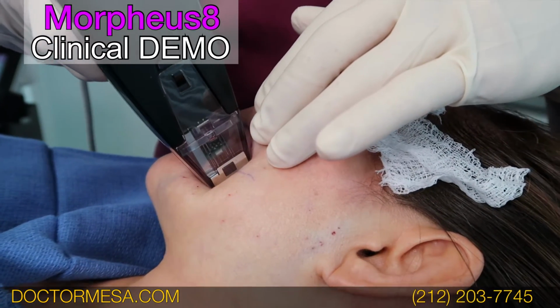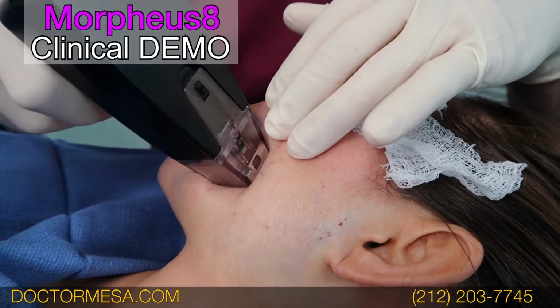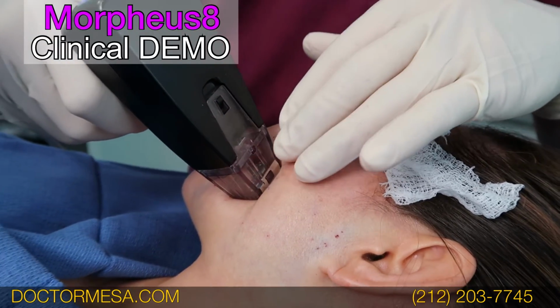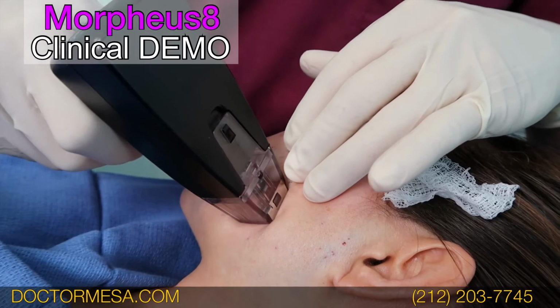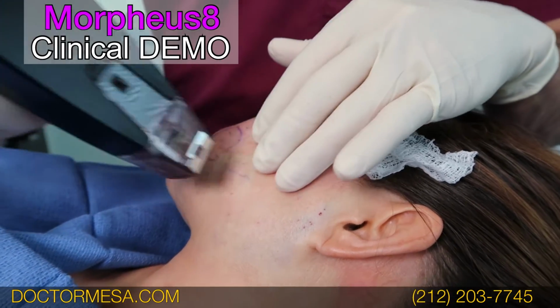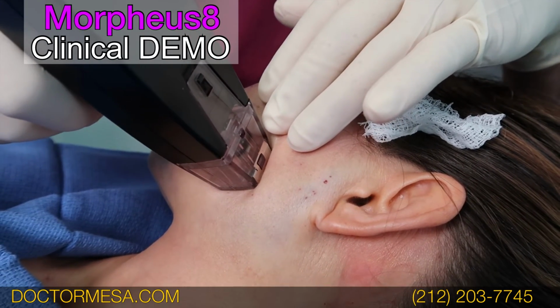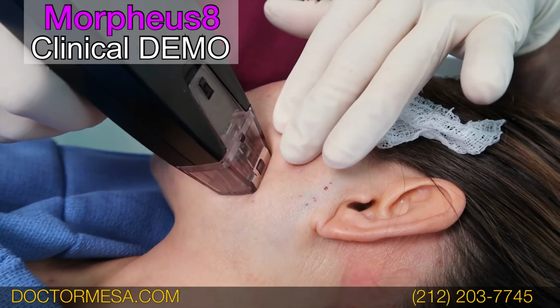Excellent. Do you have any pain? No. No pain at all. So this is the Morpheus8 in the fat remodeling mode. That is 4 millimeters deep, goes into the fat and produces tightening of the skin and the fat. Sorry, melting of the fat.